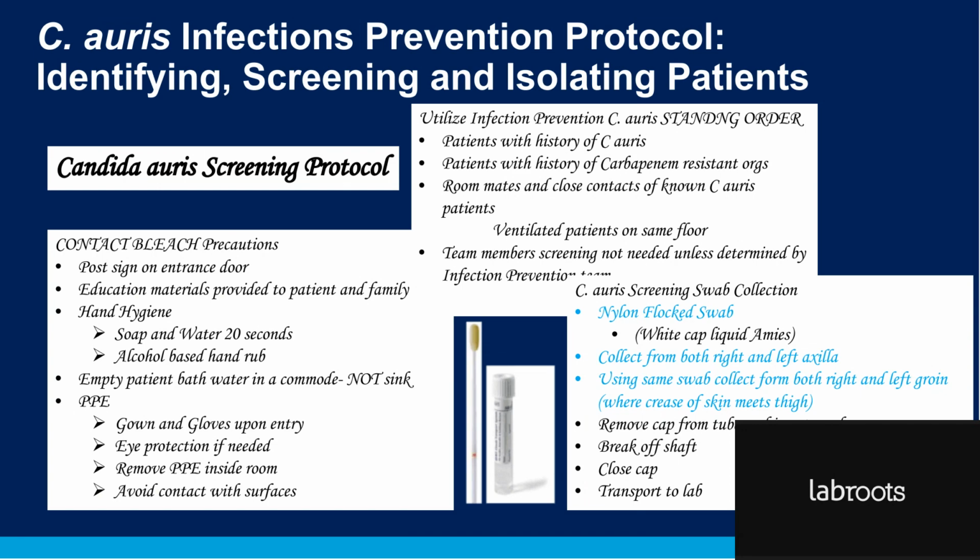We're using nylon flocked swabs. Those that come in a white cap with liquid amies seem to be what is also being used in the literature from what I've seen, and we're instructing everybody to collect both the right and left axilla, and then with the same swab, collect the right and left groin, and then bring these to the lab.